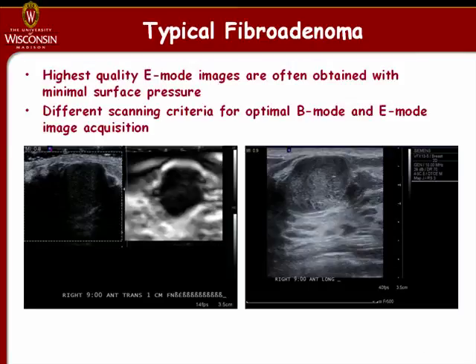image. And that is by comparing the B mode image associated with the elasticity versus the normal B mode for typical breast ultrasound, you see that there's very good contact with the transducer here. Typically you press hard enough to flatten tissue surfaces out. But an elasticity image is obtained typically with the transducer just barely in contact with the skin surface.